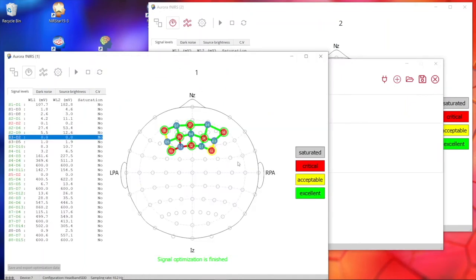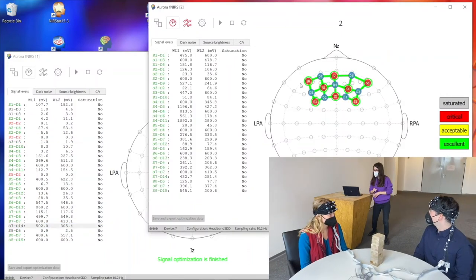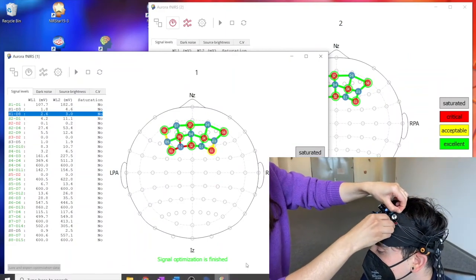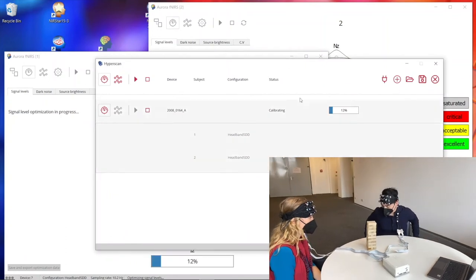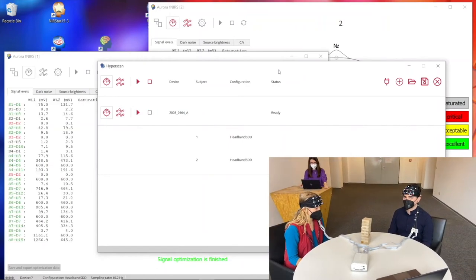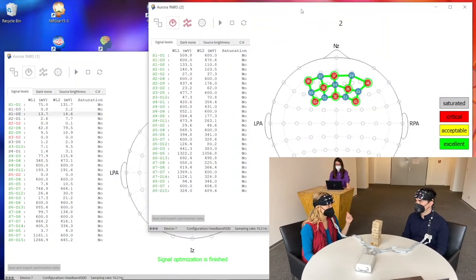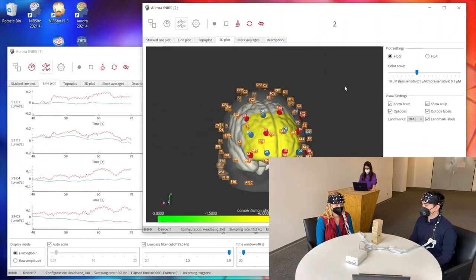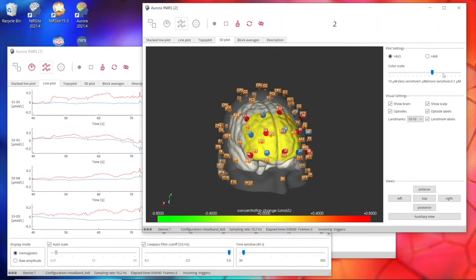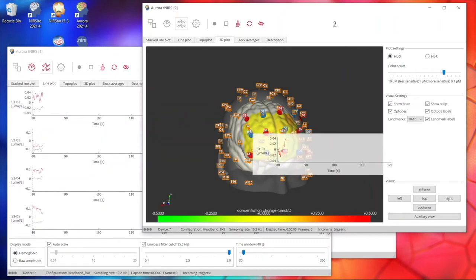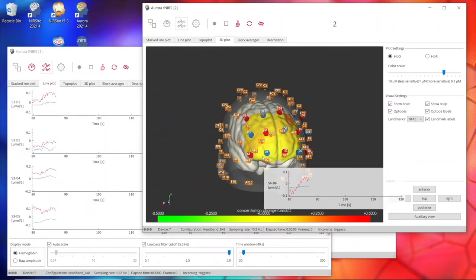Subject one had one problematic detector, so we had to check it — just some cap preparation. Once resolved, we ran the calibration again to get all channels green, as subject two already had. Once all channels are green or at least yellow-acceptable, we proceed to recording. All controls for all subjects are managed from the Hyperscan application, while the individual Aurora instances are used just for visualization. You can still use all visualization tools — 3D plots, individual channels, checking for noise, specific activations, or heartbeat signals.